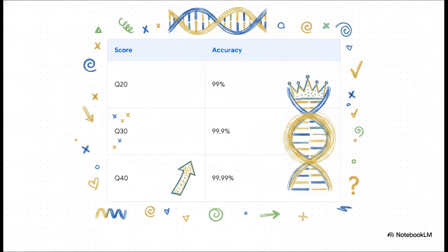We're looking for the gold standard here, which is a Q30 score. A Q30 score means there was only a 1 in 1,000 chance of an error. That gives us 99.9% accuracy. In the clinic, we literally only want to rely on data that hits these incredibly high-quality metrics.